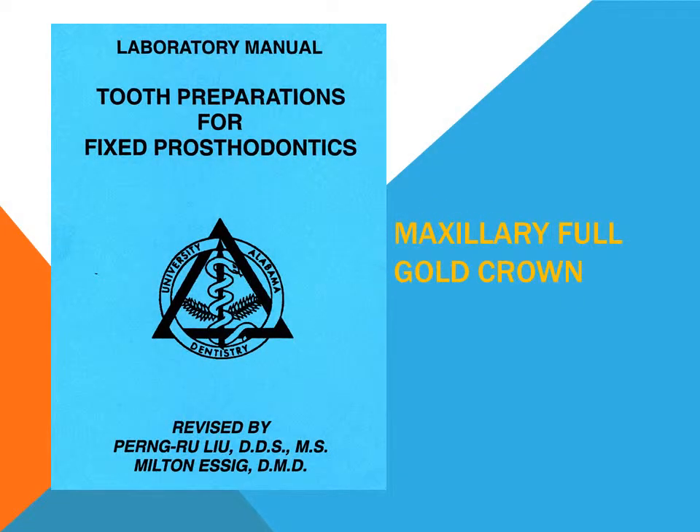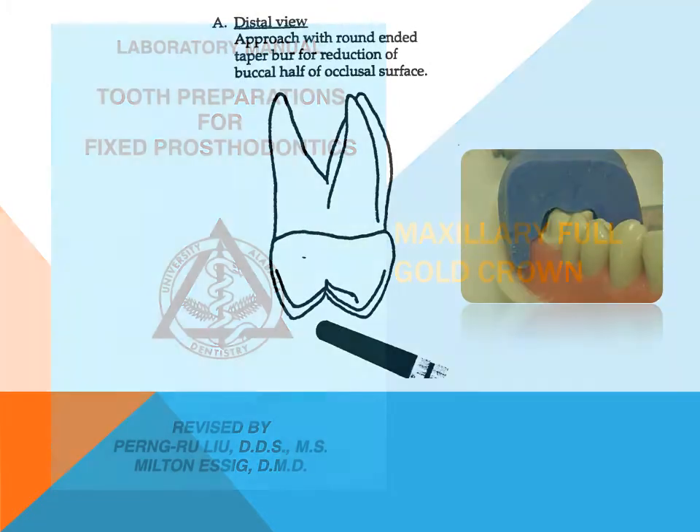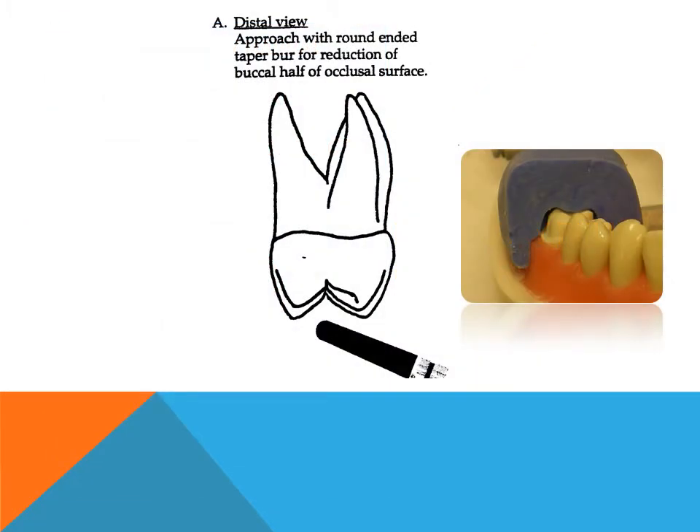Preparation for Full Gold Crown on Maxillary Molar: Occlusal Reduction. The entire occlusal surface must be reduced to establish sufficient clearance for gold coverage. The basic outline of the occlusal anatomy of the tooth should be maintained. With a buccal approach of the handpiece, a round-ended tapered diamond burr is used to reduce the buccal half of the occlusal surface. The stone is held parallel to the inclined planes of the buccal cusps and brushed across the tooth surface until 1.5 mm of tooth structure has been removed.